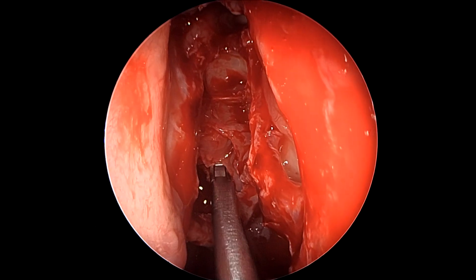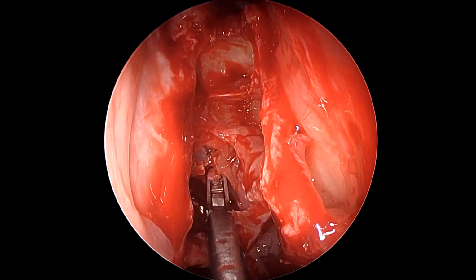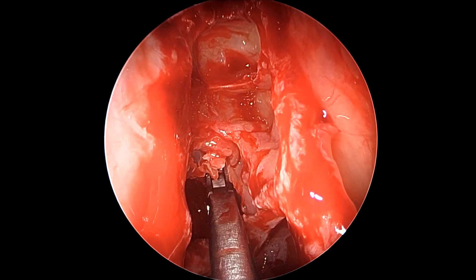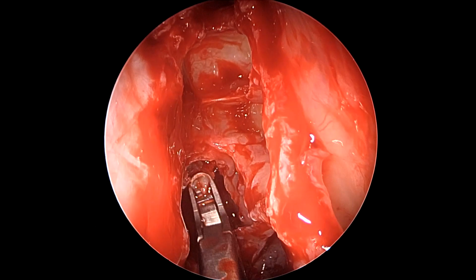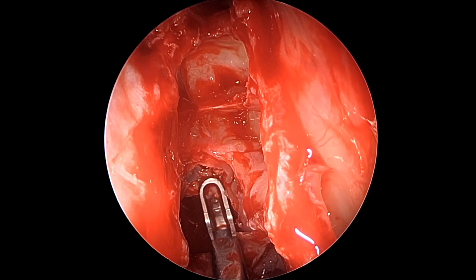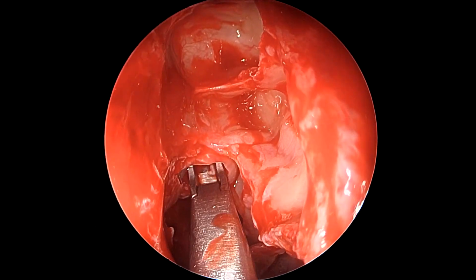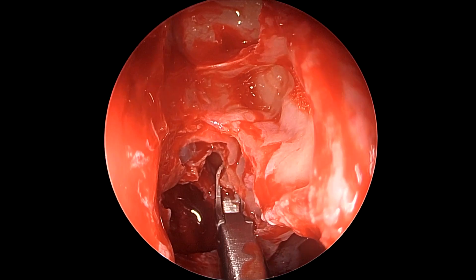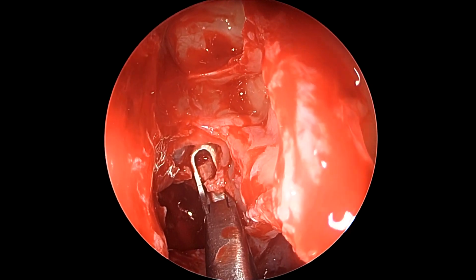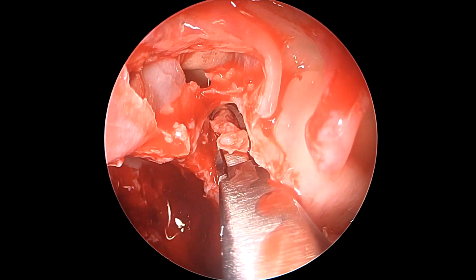So here we now take our forceps. You can see there is still a thick septation in the posterior ethmoidal cavity, which impairs our vision and access inside the posterior ethmoidal cavity. This is now being taken down using the straight reverse bite-through cutting forceps. Now the advantage of this technique is that one can palpate before every subsequent cut. Like you see here, we are palpating and then we are cutting and biting the bone each time under complete knowledge of how deep we have to go.